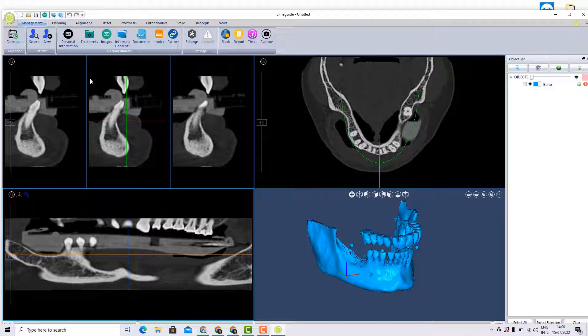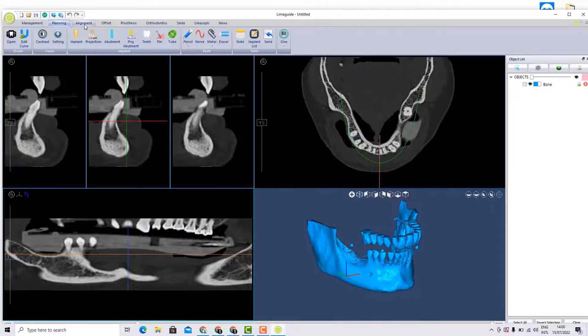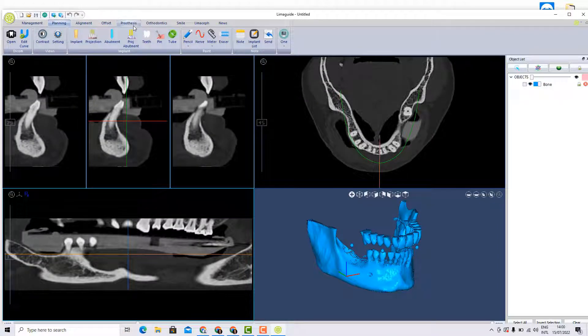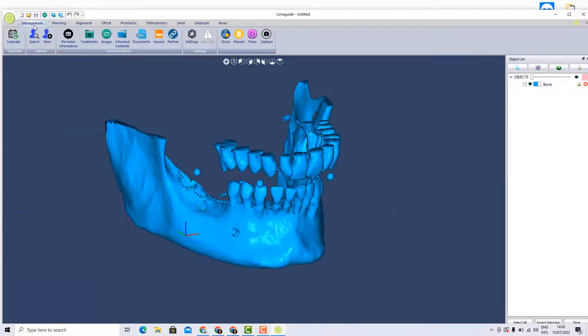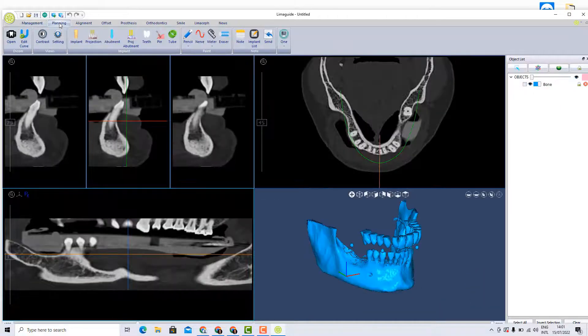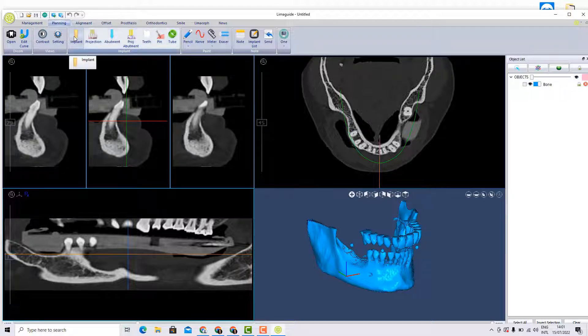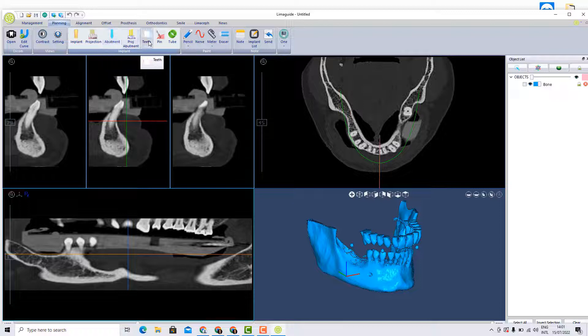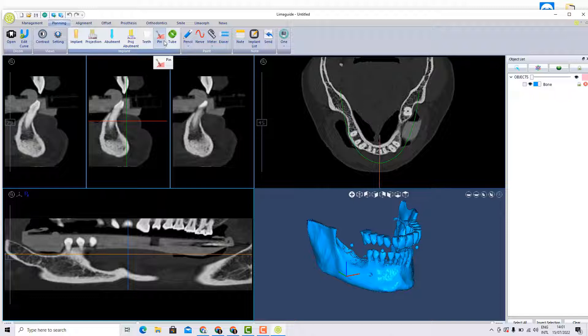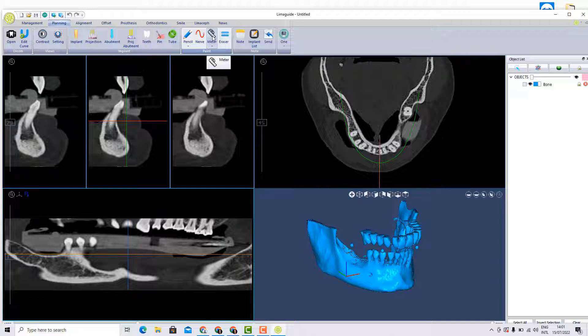On the upper part of the screen you can see different sections: management, planning, alignment, offset, etc. We're gonna talk about each one briefly. The management section is still being developed by our software engineers. For the moment, the planning section is to planify dental implants. We have the implant, the projection of the implant, the abutment to do a diagnostic wax up, the pins and the tubes once we design a surgical splint, pencil to mark the nerve, a meter for measuring the distance, etc.